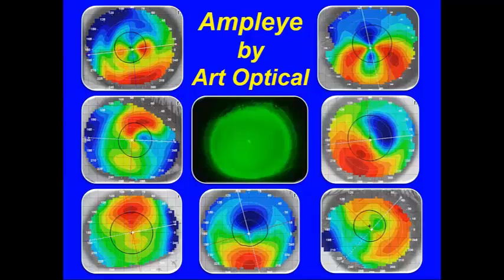If I see any impingement of those conjunctival vessels during the diagnostic fitting, I will request that we raise that area up just 1 degree. And in the periphery, that 1 degree change is indeed clinically significant. Okay, and I know the Art Optical consultants will consider that 1 degree to be 25 microns. So that 25 microns is probably going to be sufficient then.